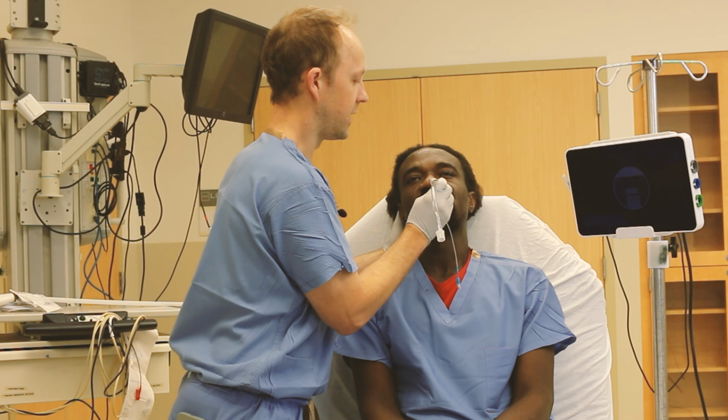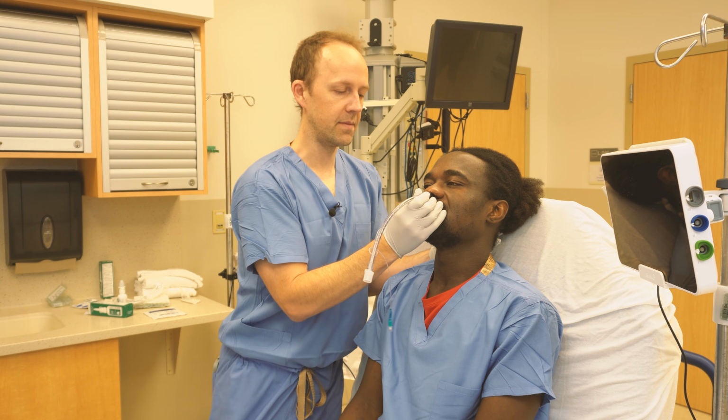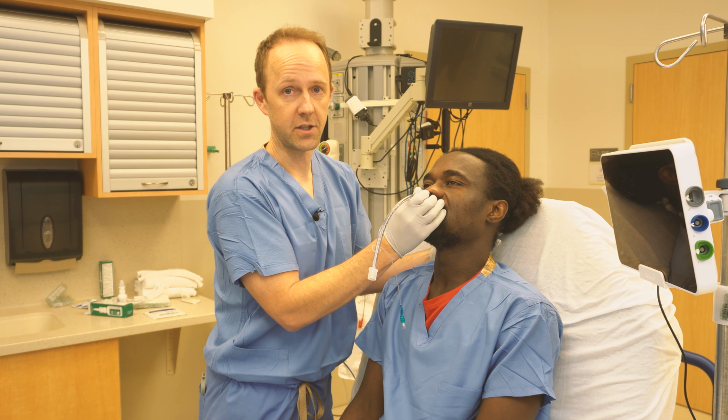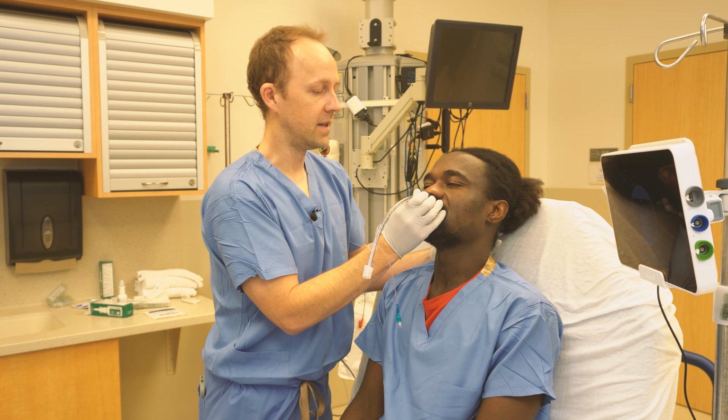So if you need a little help, you can use some midazolam. But we avoid the use of ketamine. We think that's one of the worst drugs you could use in this situation because half the time your patients are going to become dissociated and not be able to participate in the procedure.